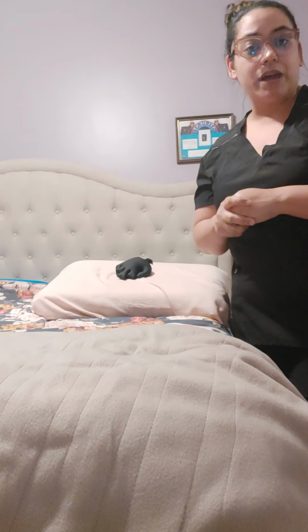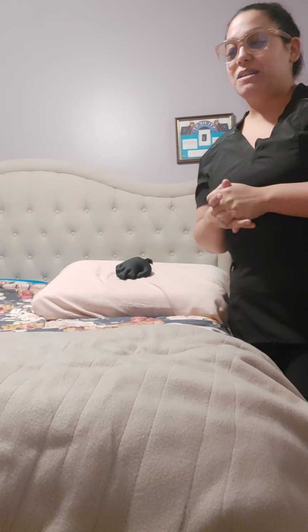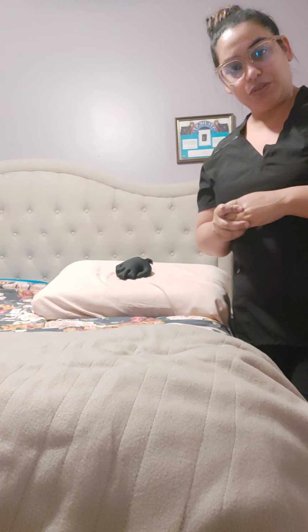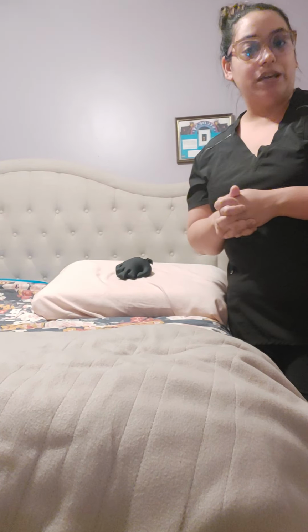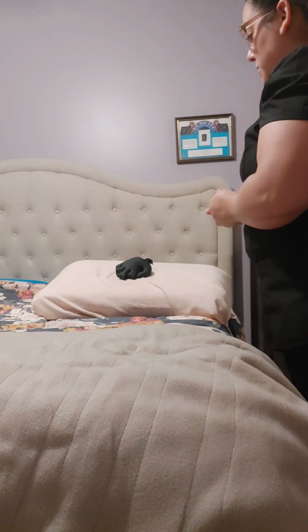Once I have gathered my supplies and my assistant, I would walk into the room, wash my hands as I'm walking in, and I will introduce myself to the patient. Hi, Ms. Gonzalez. My name is Elisa. I'm going to be your nurse today.